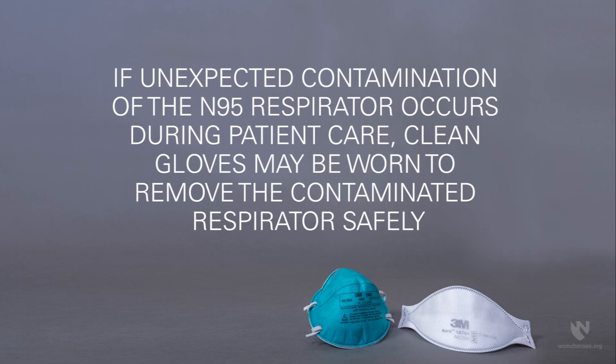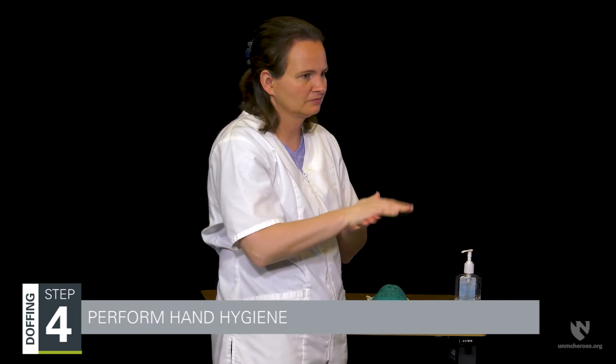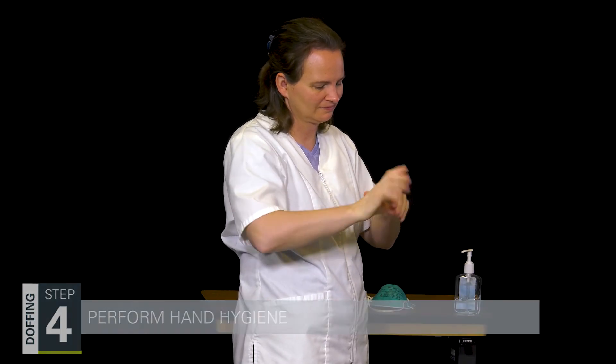If unexpected contamination of the N95 respirator occurs during patient care, clean gloves may be worn to remove the contaminated respirator safely. Step four is to perform hand hygiene. Hands should be cleaned to ensure any contamination from the doffing process has been removed before moving on to other clinical activities.